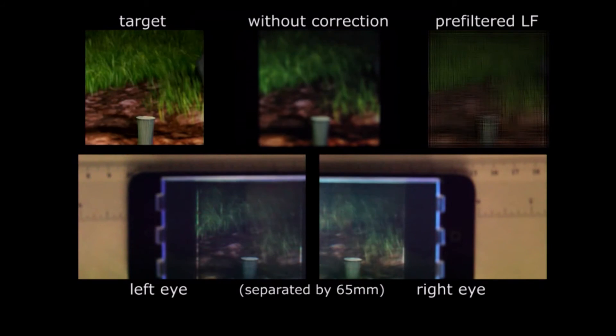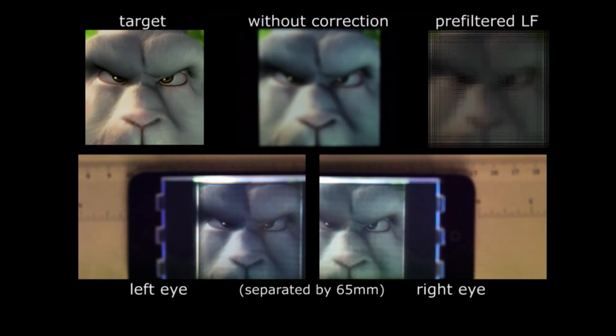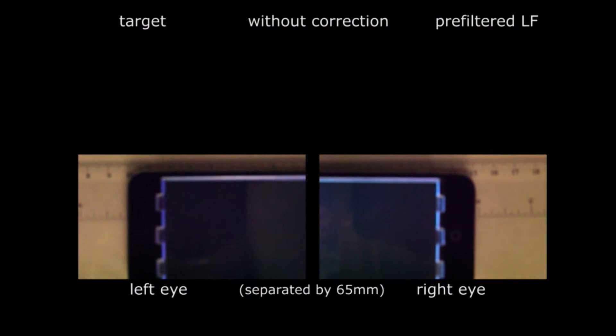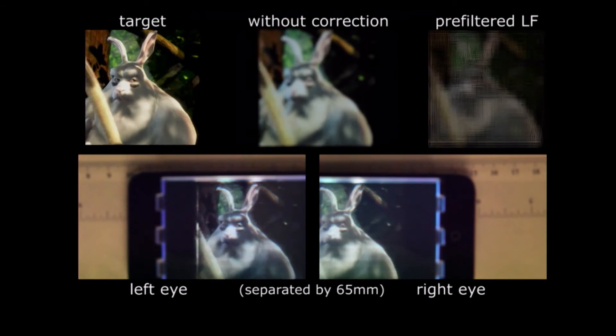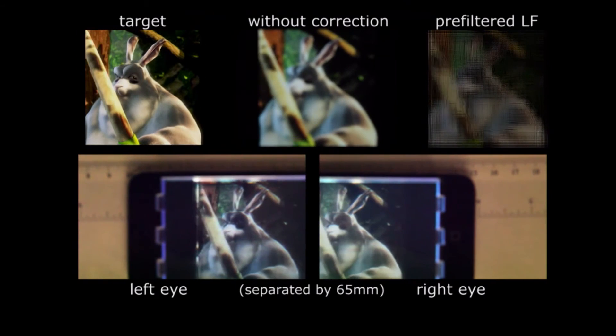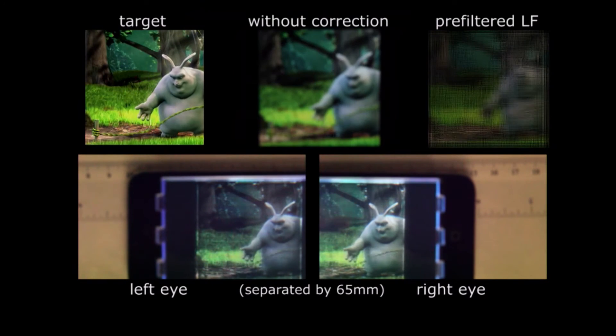So in this work, we use a light field display to correct the vision problem. We design both the hardware and the algorithm so that when showing the pre-filtered light field content, the observer can actually perceive a sharp image.